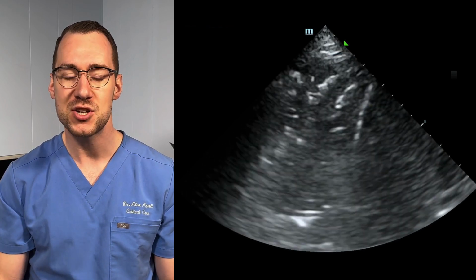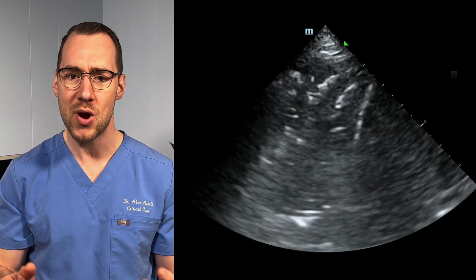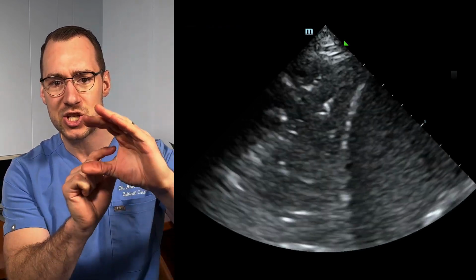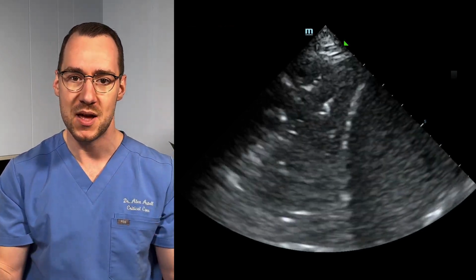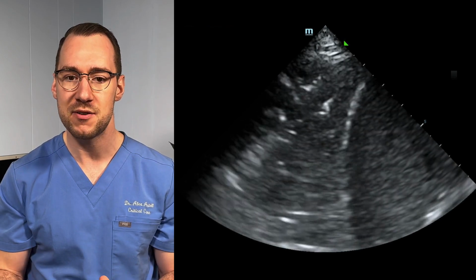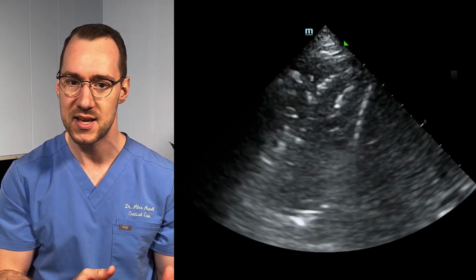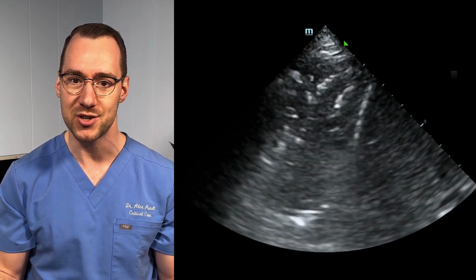The literature definition requires 1 millimeter of movement to be termed dynamic, so for practical purposes, if you can see shiny mucus moving within an airway as the patient breathes, you have dynamic air bronchograms. Dynamic air bronchograms are associated far more with an infectious process and are usually a good indicator that pneumonia is the cause of our consolidation.